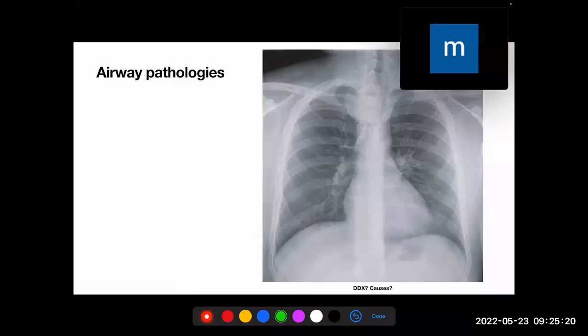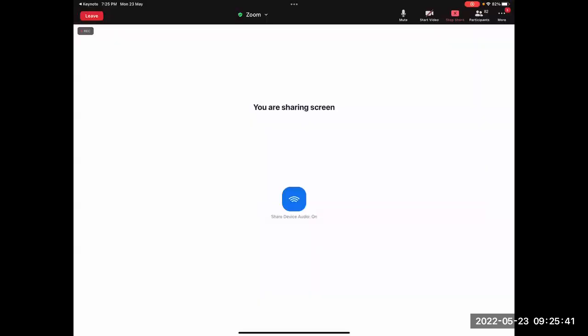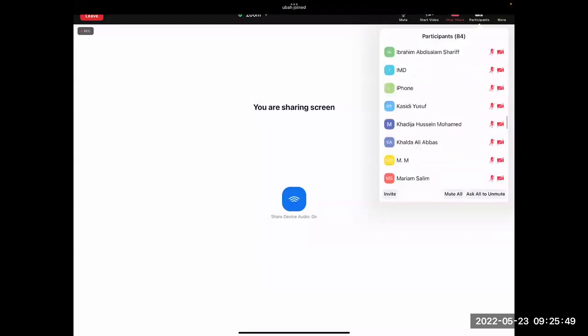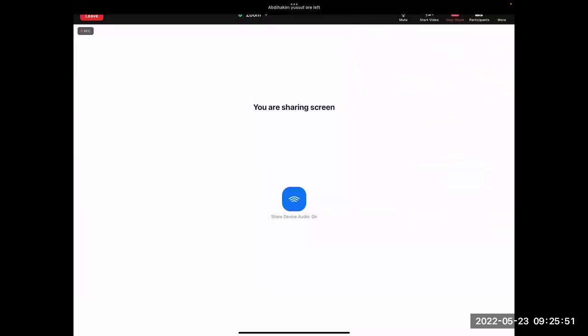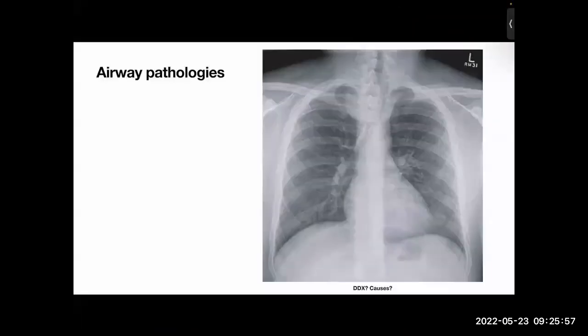Okay. Look at that. Who will take us through that one? I need people to be talking. Hello? Are people afraid? Or I start calling people. We have about 80 people here. Now nobody's talking. You guys can still see my screen, yeah? Yes, Doctor. Yes, you can.